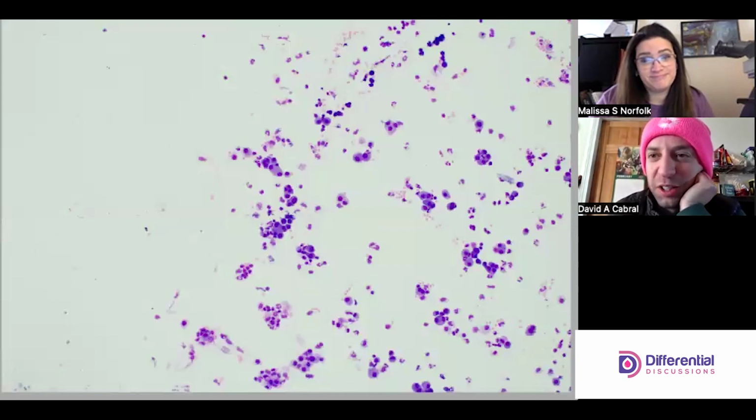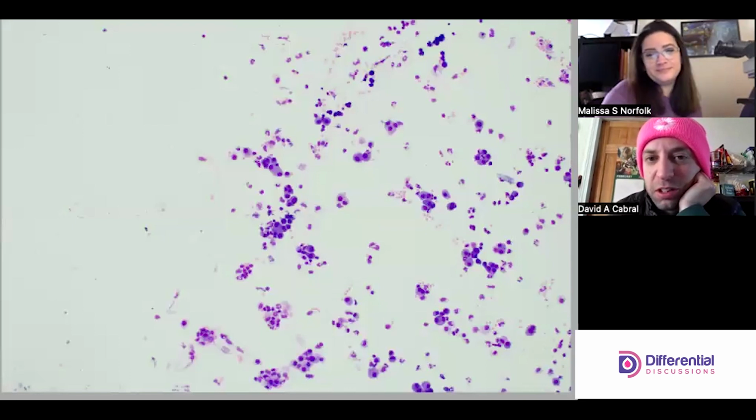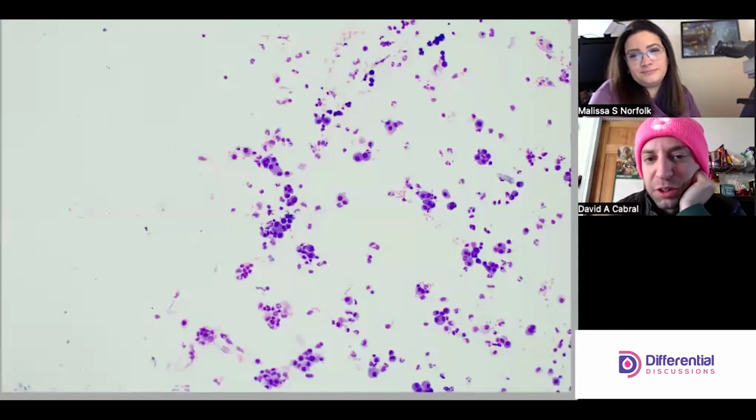Your favorite morphologist, looking at body fluids. So, yeah, we've done a decent amount of serous fluid so far.